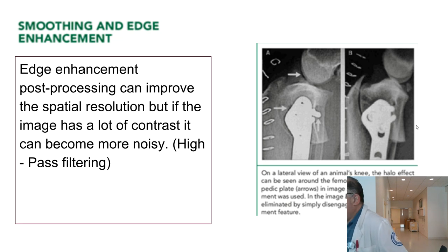And someone asked a good question in the last class. So which one's better, Professor Lobel? Neither of them are better, right? It all depends on what your diagnosis is. And do you feel the need to use edge enhancement or smooth the image? Usually you wouldn't smooth an image unless it was noisy to begin with, right?